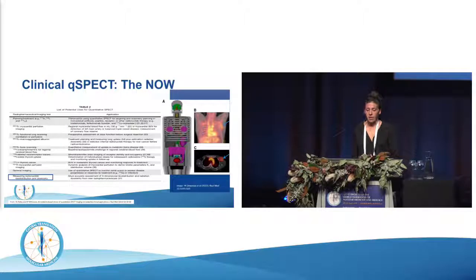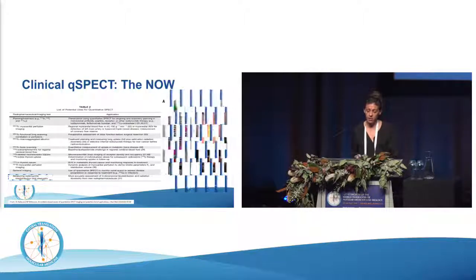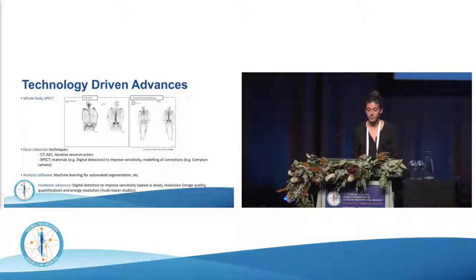And then finally, measuring radionuclide biodistribution and dosimetry. This is something that I think we'll be seeing a lot of, and quantitative SPECT clearly has a lot to offer here. Traditionally, a lot of this work's been built on 2D planar data, which has issues in the quantification stage and also has issues in the organ delineation stage. So if we can address both of those things with 3D fully quantitative SPECT CT, I think that's a very big step forward. And there is a huge amount of literature on this now.